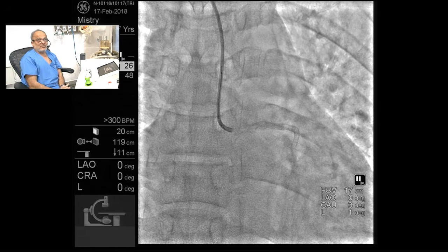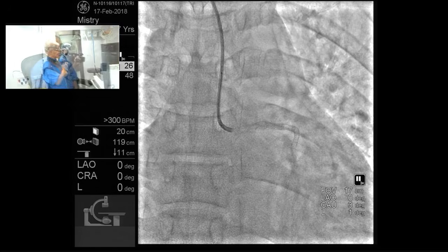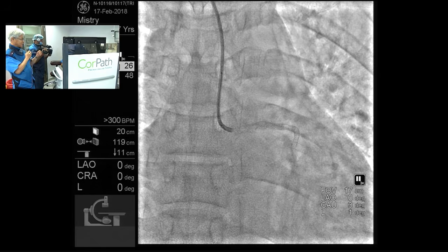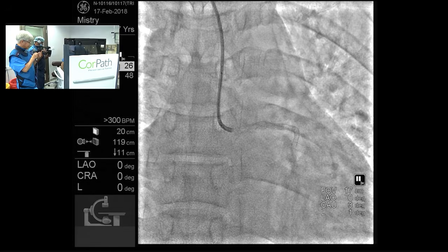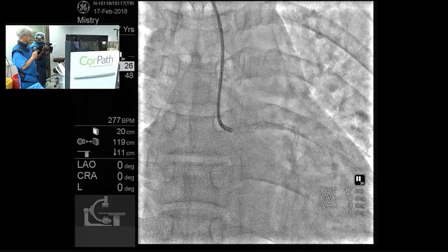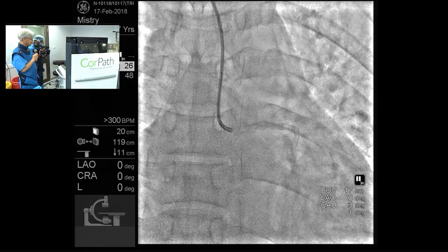Professor, what is your comment on this? Yeah, I agree. It's the best way to learn a new technique. And may I ask another question? In daily clinical practice, if the balloon is difficult to pass distally, sometimes we pull out the wire a little bit and it goes in. So using this machine, is it possible? Yeah. Sometimes I play with all these 3 knobs. I push this back, pull this a little back and push it in. It is basically hand-eye coordination, a coordinated movement of your fingers and hands.